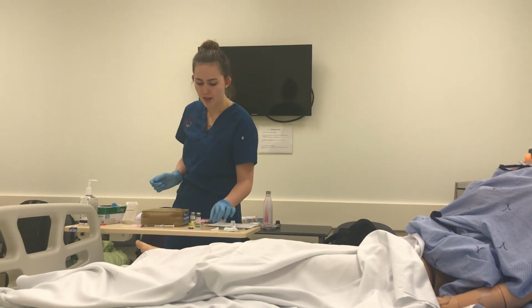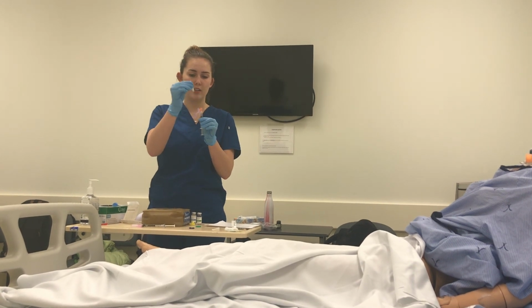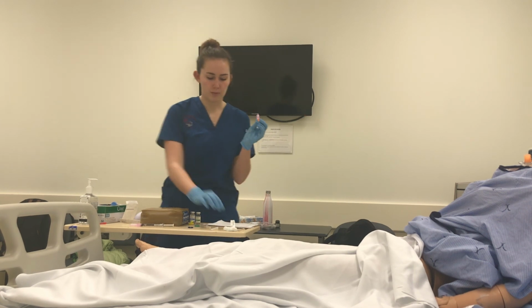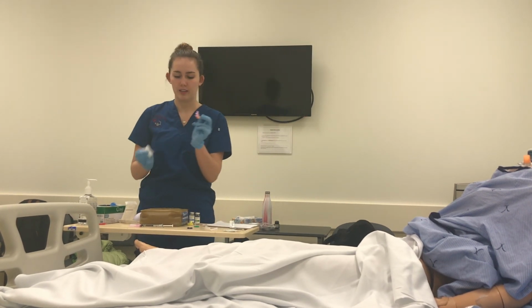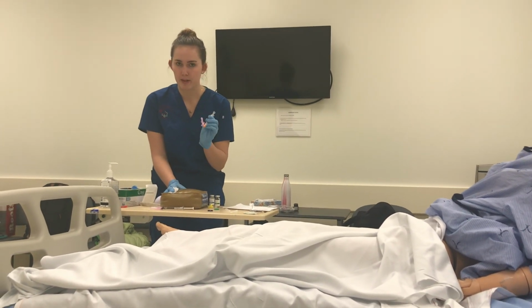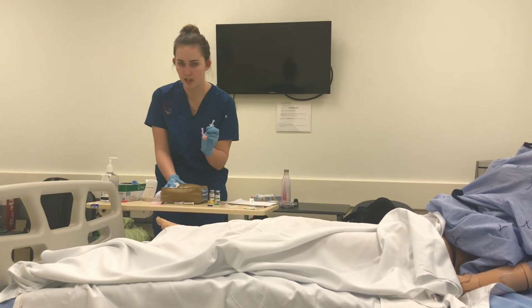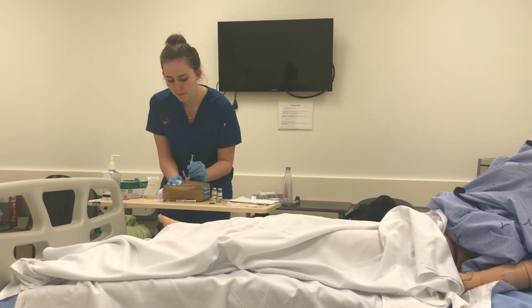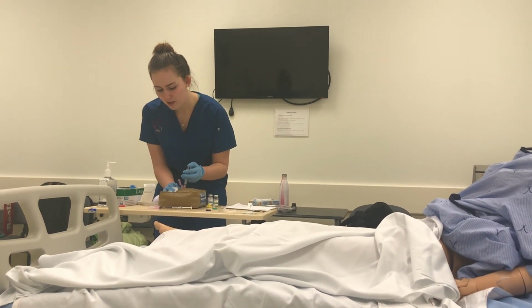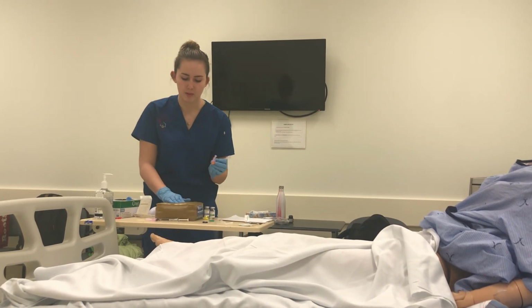Okay. Now what we're going to do is remove the safety on this and uncap the needle. We are going to make sure that you put a piece of gauze in your non-dominant hand, and you're going to pinch the injection site and administer the medication. Since this is heparin, we're going to continue to pinch the injection site while we are actually injecting the heparin. Okay, now remove the needle and replace it with gauze.